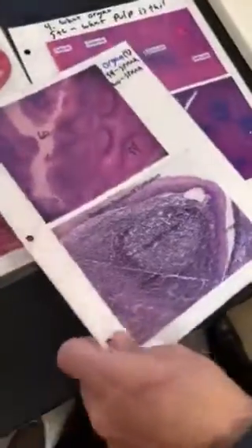This is a tonsil because it has crypts. So crypts are just like the gaps, right? Yeah.